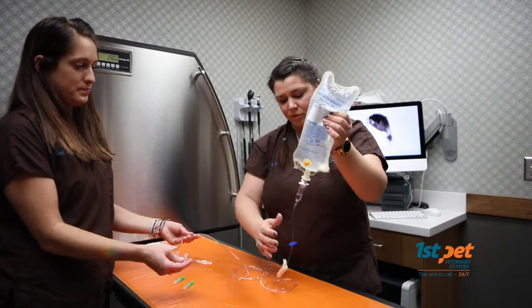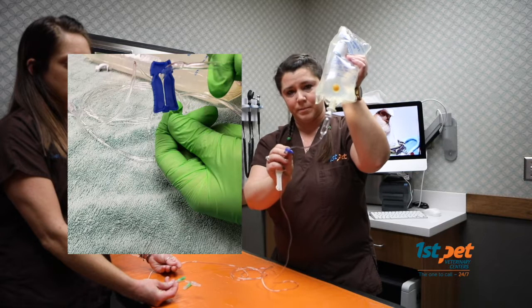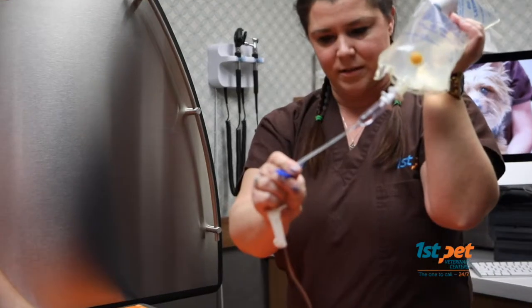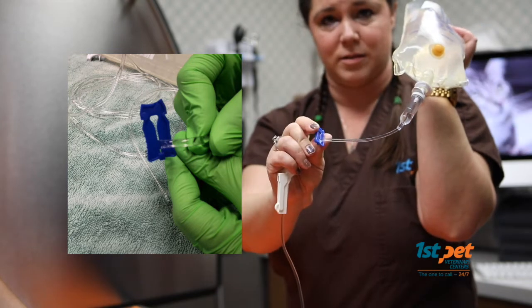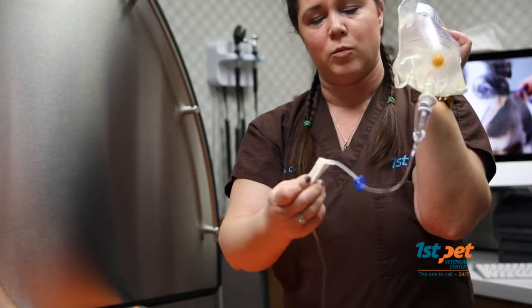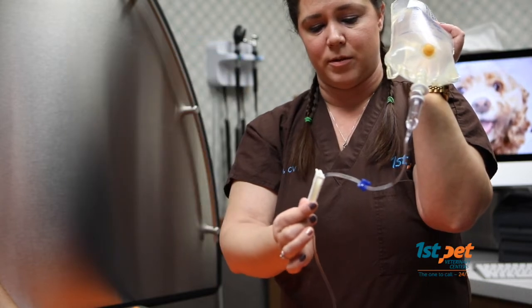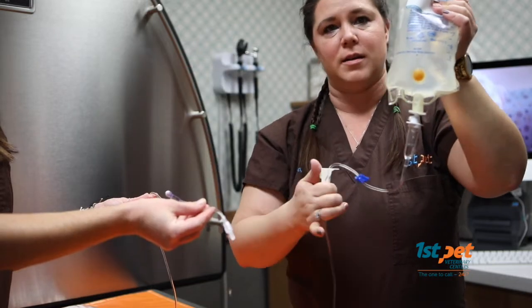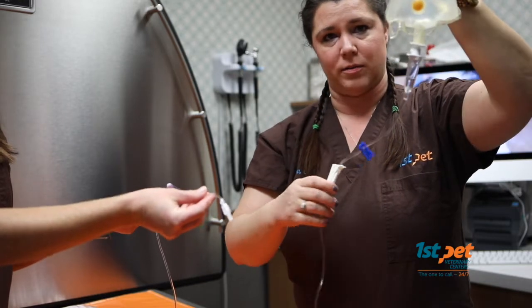And one other important thing to remember on all these lines, you're going to have two separate clamps. We have this blue clamp. This is called a pinch clamp. If you squeeze it the other way, you can see we're squeezed close on the line so that the line is closed. This white clamp is called a roll clamp. When we're in the down position, we're closed off so fluid can't flow through. Once you roll it up, you can see that fluid comes through the line in a flowing, easy pace. So I'm going to go ahead and roll it back down, and now our fluids are off.